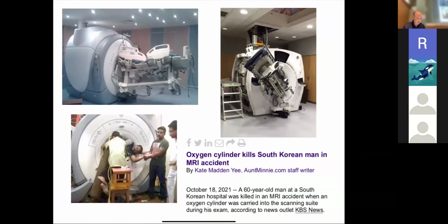One of the most important things that you can learn from this course is magnets are dangerous, okay? If you learn nothing else, you need to learn that. A common question is, how do I know if the magnetic field is on or off? Because it doesn't make a sound, right? Magnetic fields don't announce themselves and say, I'm on, right? So you should always assume that the magnetic field is on, all right? And if you forget that, things like this can happen, okay?